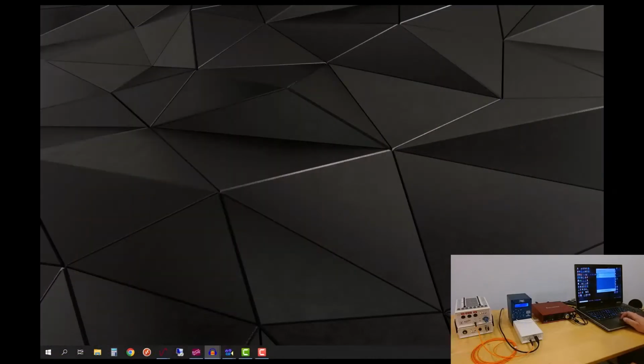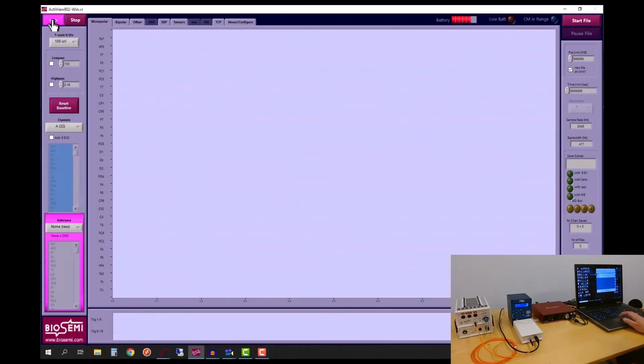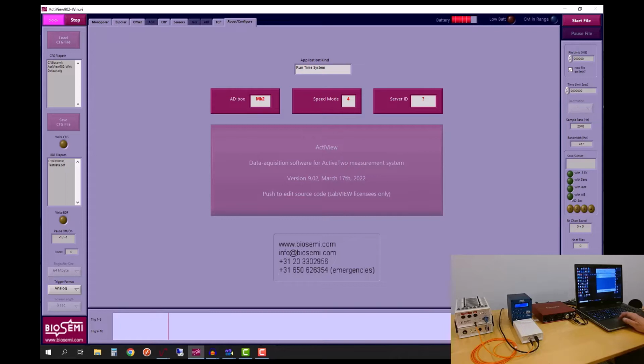And in the EEG software, if I start this, you'll see that with each click there's a colored line that appears. So that colored line indicates that one bit is being raised momentarily. And I'm going to go in the EEG software and change the screen length for the moment, just so that it's a little easier to see multiple repetitions of this sound. And let's just start it again. And I'll go over here and use the automatic repeat.